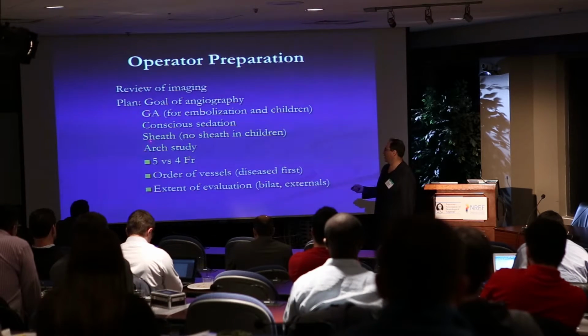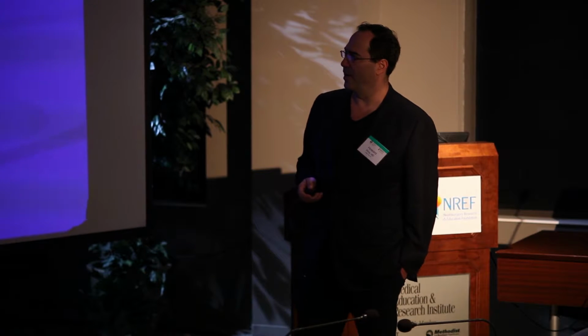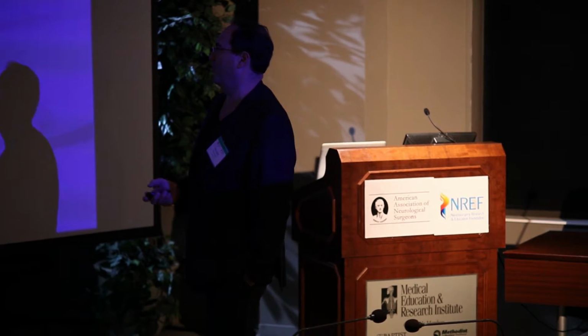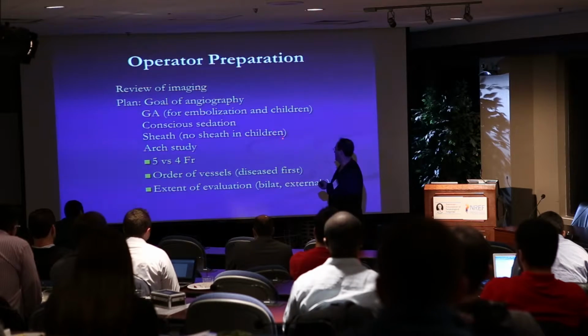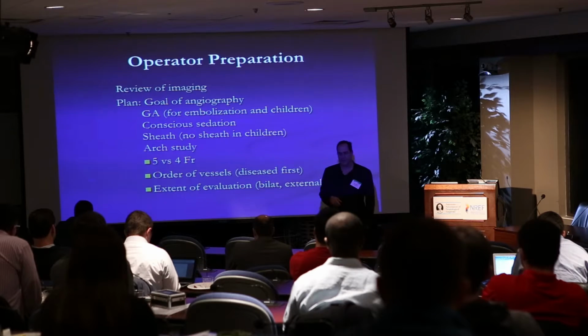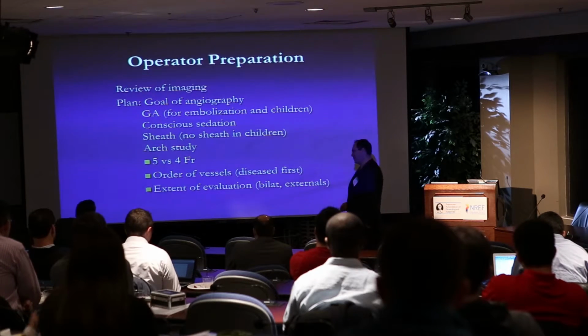Conscious sedation, at most institutions now you have to be certified in conscious sedation, and you can do this as residents. Our residents are certified, isn't that correct, Omar? So our residents are certified in conscious sedation. Whether or not you want to use a sheath, again, we don't use a sheath in children, but I use a sheath pretty much for everything else. That is not the standard radiology way of doing an angiogram.